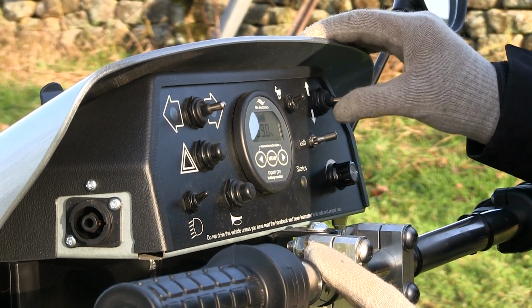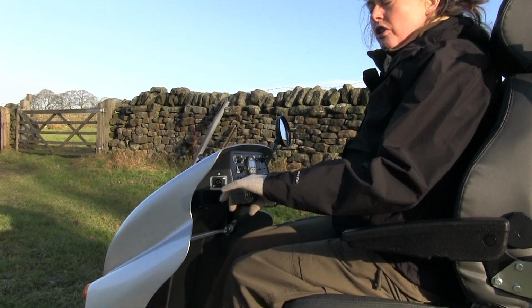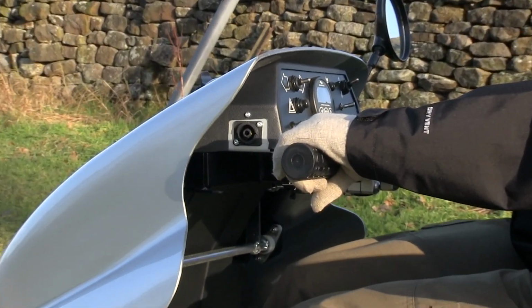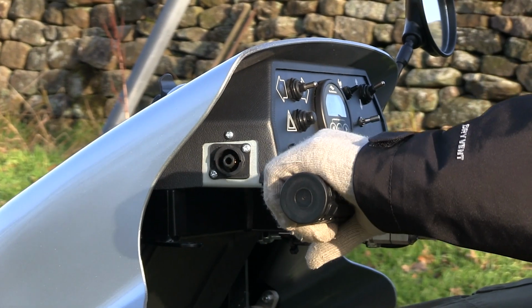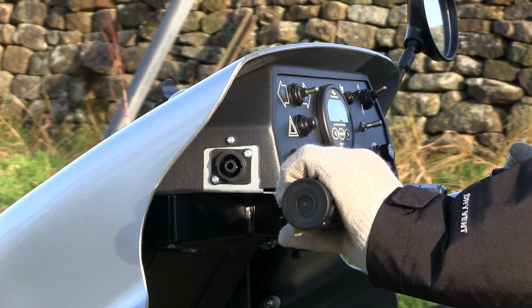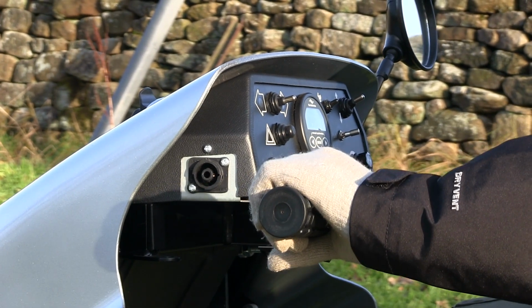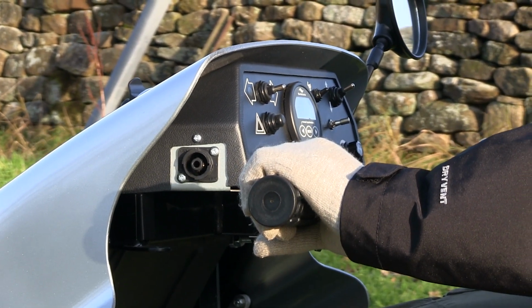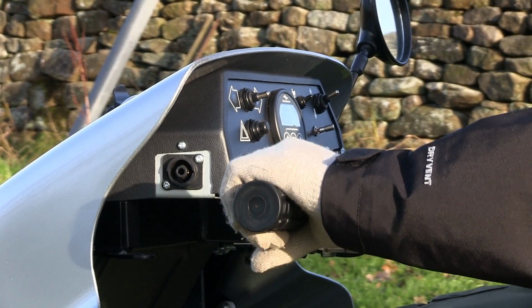So the next thing to consider with the Tramper is which hand you are stronger with and which one you're more comfortable using, because it's a twist grip. So to go, you would pull the Tramper grip towards you. To stop, you would let go. Your hand needs to hold the grip in that position for it to move, so you need to decide whether or not you're confident with your left hand or your right hand.